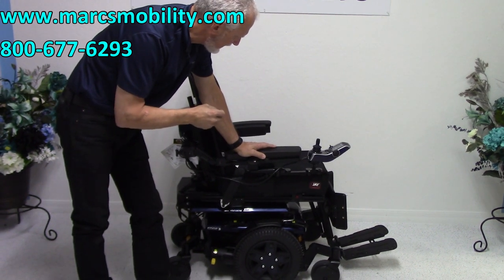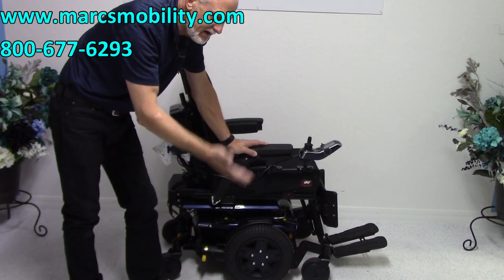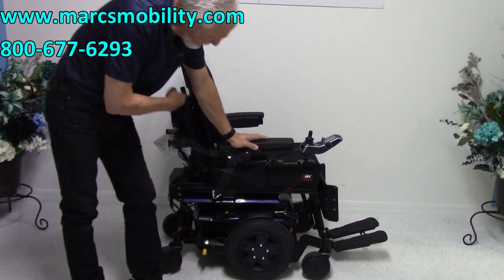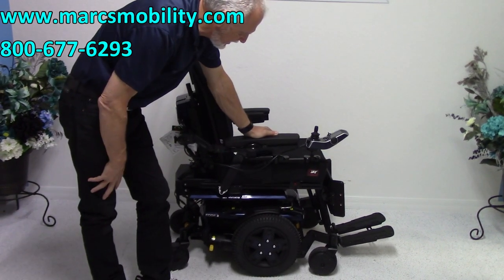This power chair has got the electric tilt and the electric seat lift. The legs are manual and the back is manual. It also has the light kit for the lights, which we'll cover in a few minutes.